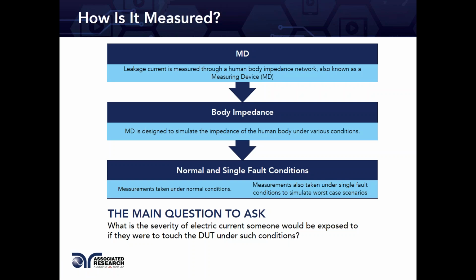Then we move on to single fault condition, a measurement taken under single fault condition to simulate some kind of worst-case scenario. What happens if the electrician at the hospital forgets to ground the outlet? If your product gets plugged into this ungrounded outlet, is there additional risk associated with your product shocking somebody? This could also mean that somebody broke off the ground pin.